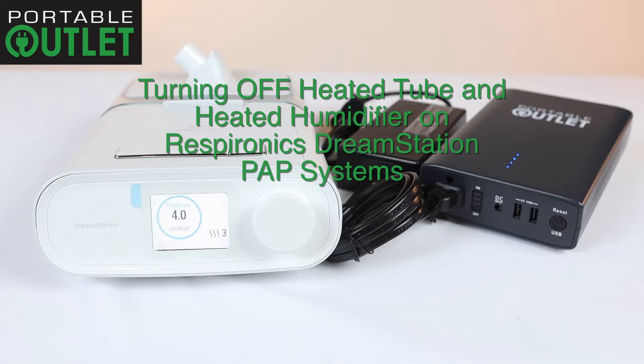In this video, we're going to learn how to maximize battery life by turning off the heated tube and heated humidifier on the Respironics DreamStation CPAP, AutoPAP, and BiPAP systems.